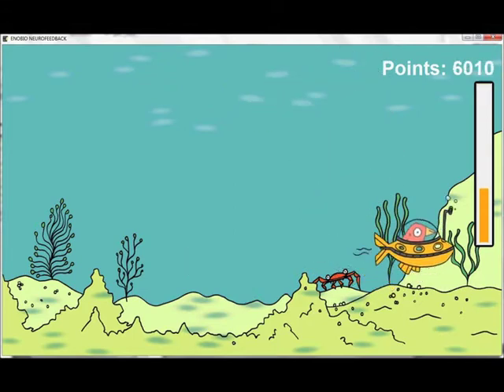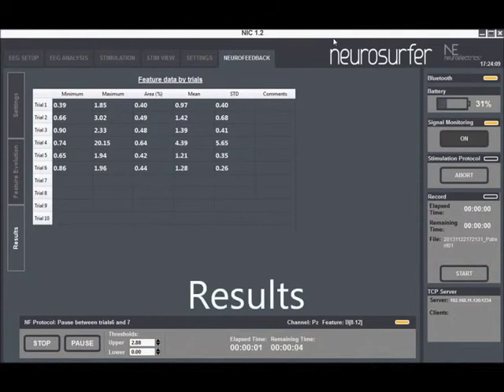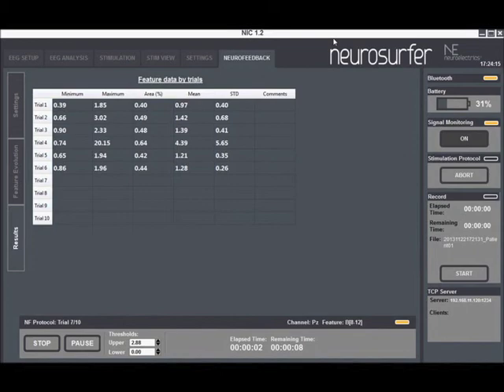Once the training session is over, the therapist has access to game statistics in order to monitor progress. These include mean scores for each trial.